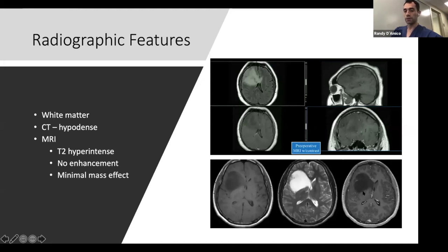What you see is the majority of the tumor is non-enhancing. If this was a glioblastoma, you would typically see a rind of enhancing tissue all the way around it. Here, there might be some enhancement. It could also be blood vessels, because blood vessels obviously carry contrast, and that could be enhancing a little bit as well. But this is a very large right frontal low-grade glioma, and very classic for it.